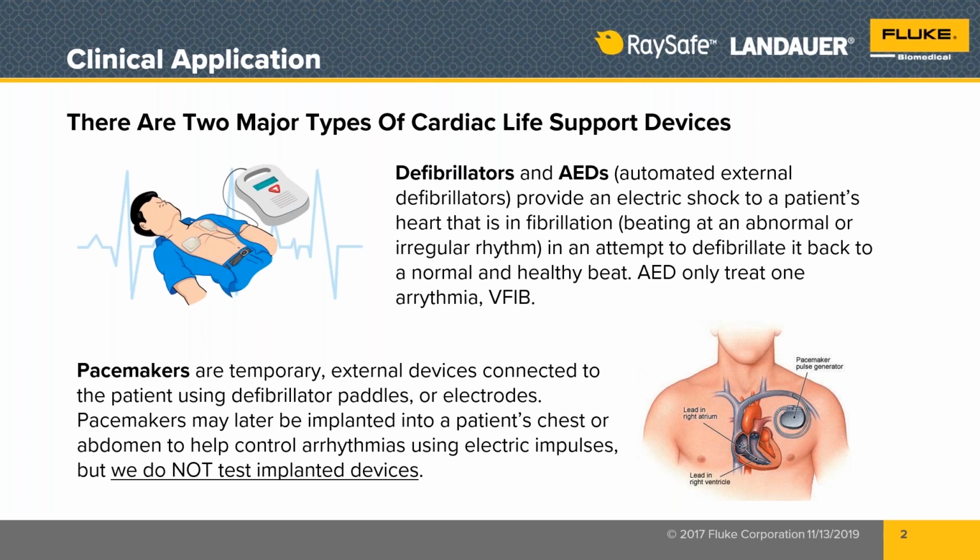In defibrillators, we actually have two major types. We have full ACLS, which is advanced cardiac life support defibrillators, and these allow the doctor or paramedic to select the energy levels and be in a little bit more hands-on control of the defibrillator.